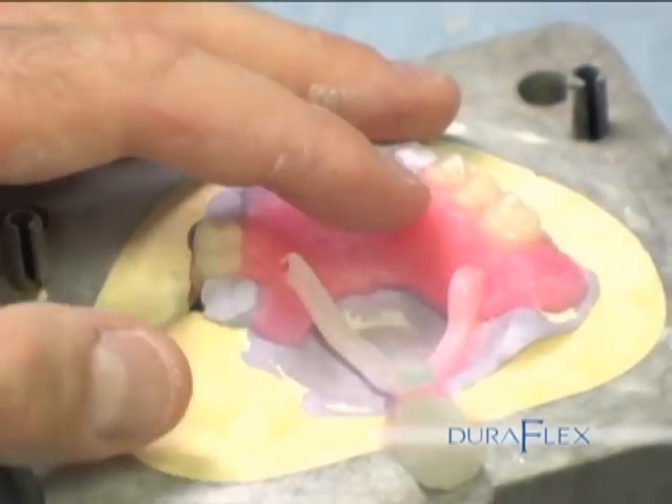For most cases, two or three sprues will be enough, but for smaller cases, one or two will be fine.